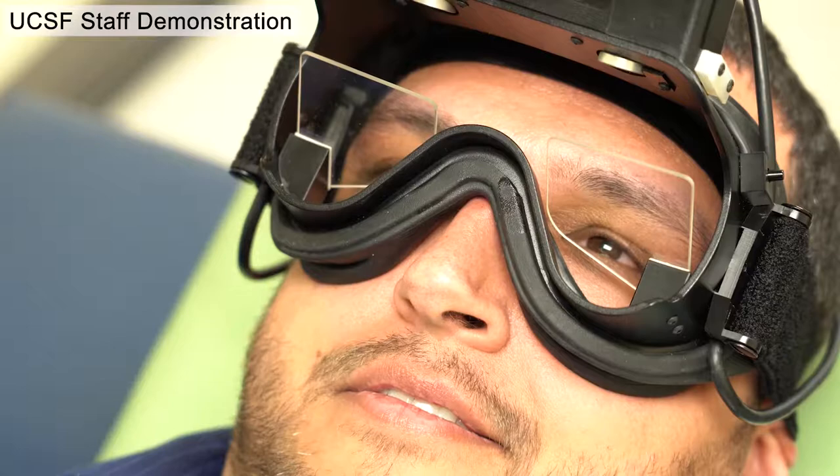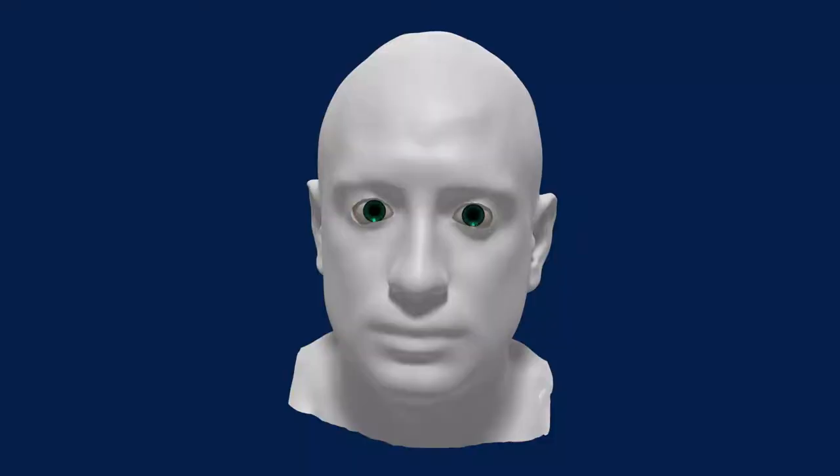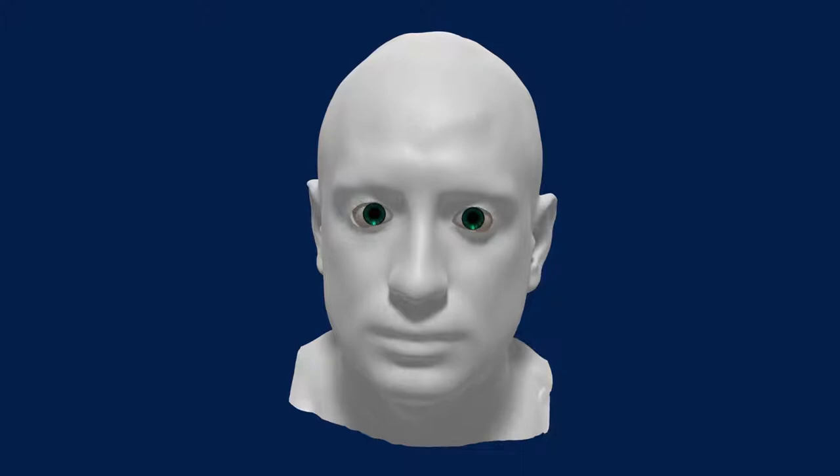Why measure the eye movements? One of the important functions of the vestibular system is called the vestibulo-ocular reflex. When the vestibular system senses head motion, this reflex causes the eyes to move in their sockets to compensate for the motion, which allows them to smoothly stay focused on a stationary object. Through this reflex, your eye movements can provide a lot of information about your vestibular system.